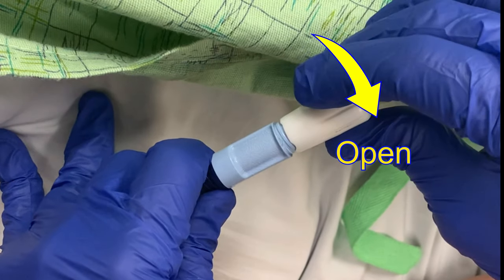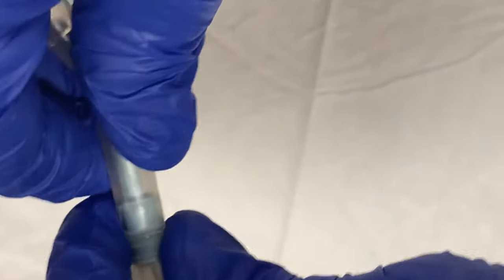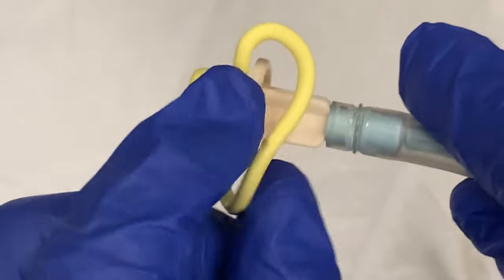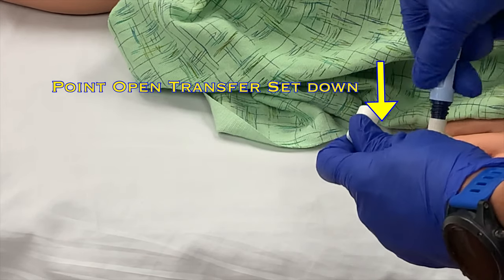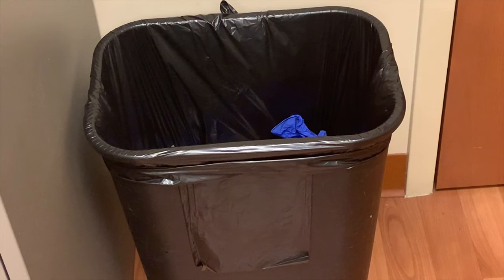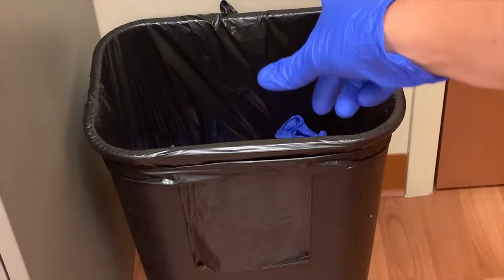To open the patient clamp, twist the white base counterclockwise. To close it, twist it clockwise until you feel a click. Now you need to break the blue frangible by repeatedly bending it back and forth. When it's effectively broken, there will be a gap between the tab and the base. Remove the yellow pull ring. Now take the patient's transfer set and, aiming it down, remove the white mini cap. Insert the opening into the UltraBag system and twist them together tightly. You do not need to clean the transfer set with alcohol because the mini caps are impregnated with iodine that keeps the tip of the transfer set sterile. Because of this, these are one-time use caps — dispose of the mini cap, as you'll need a new one every time you recover the transfer set.